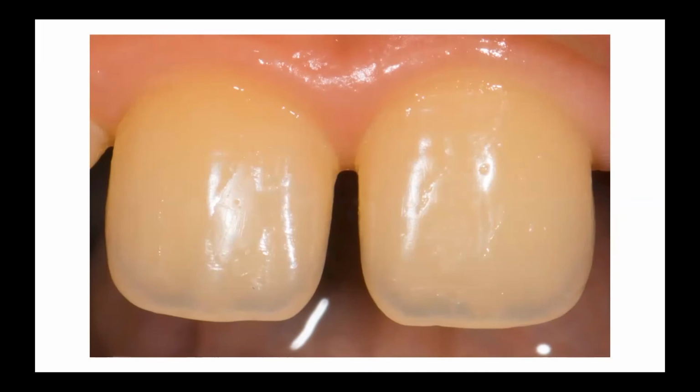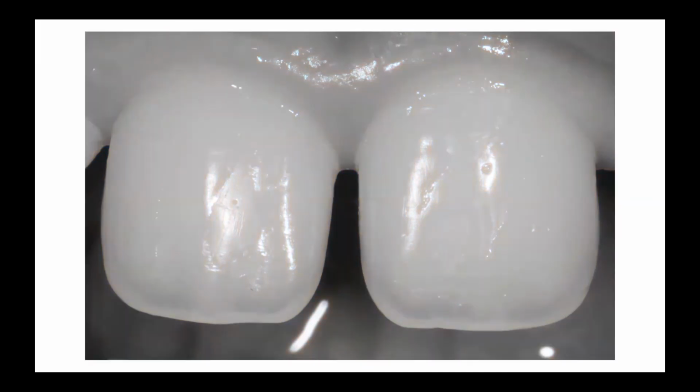And when we increase the saturation of our picture or reduce it and get this picture in black and white, our observation is confirmed.